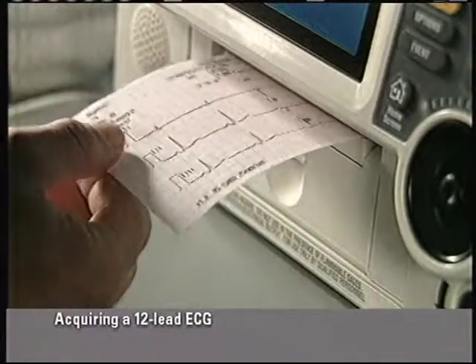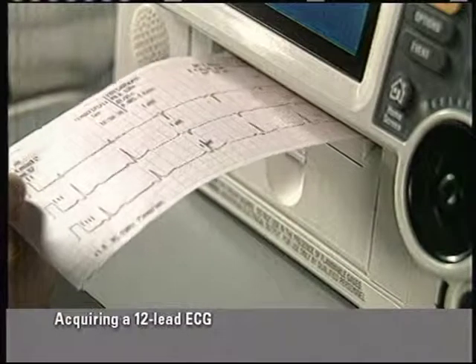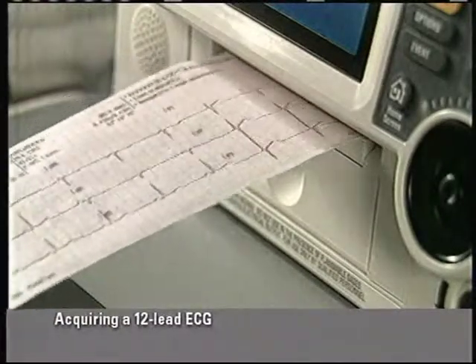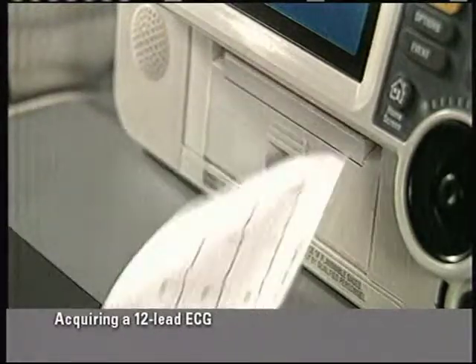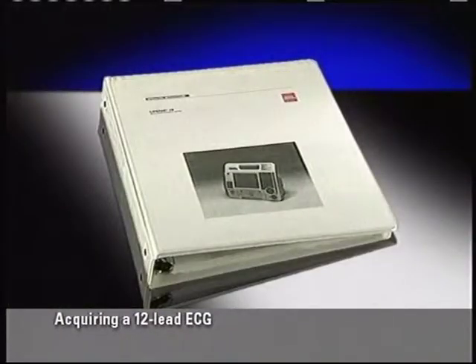The LifePak 12 defibrillator monitor is configured to print the 12-lead report in the 3-channel format. Standard 4-channel and Cabrera formats are also available. Consult the operating instructions for more detailed information about these formats.